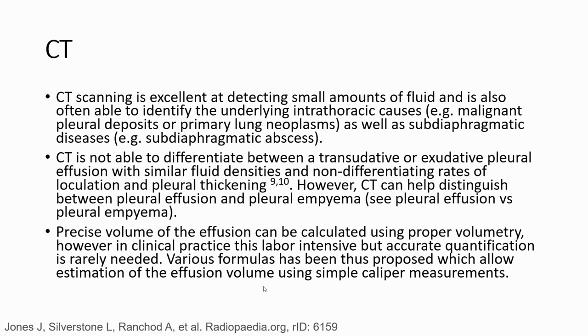Precise volume of the effusion can be calculated using proper volumetry. However, in clinical practice this is labor intensive, and accurate quantification is rarely needed. Various formulas have been proposed, which allow estimation of the effusion volume using simple caliper measurements.